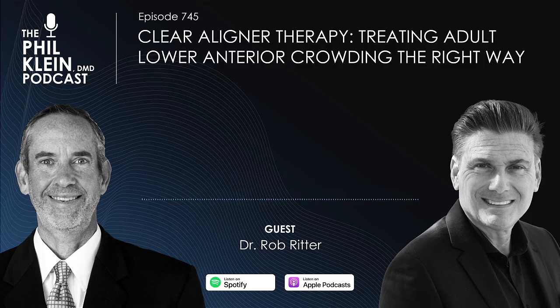and I'm talking about just simple, let's say Invisalign, because that's what we use. We have Align scanners, we use Invisalign, even though there are other companies out there. I like to see people move into those trays because then after the teeth are straight, a lot of times patient says, you know what? Maybe the teeth are not the color I'm looking for, or my teeth are a little short in the front. All of those things cosmetically can be fixed once the teeth are in the right position, but we got to get you there first.